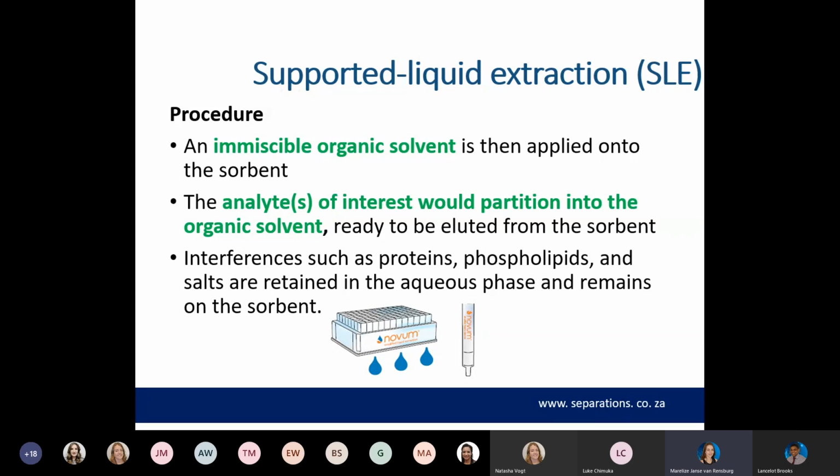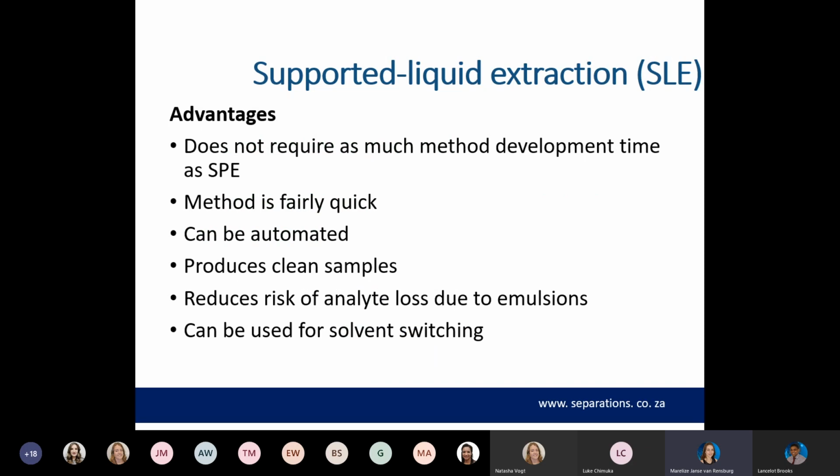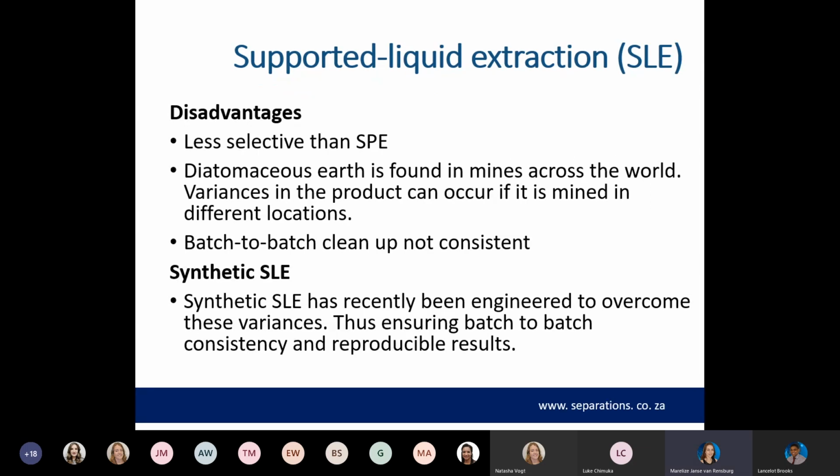Interferences such as proteins, phospholipids, and salts that interact with the aqueous phase remain on your plate, and therefore you have a much cleaner sample at the end. The advantages of supported liquid extraction, also SLE: it does not require as much method development and time as SPE does. The method is fairly quick, it can be automated, it produces clean samples, reduces the risk of analyte loss due to emulsions, and can be used for solvent switching. The disadvantage is that it is less selective than SPE.